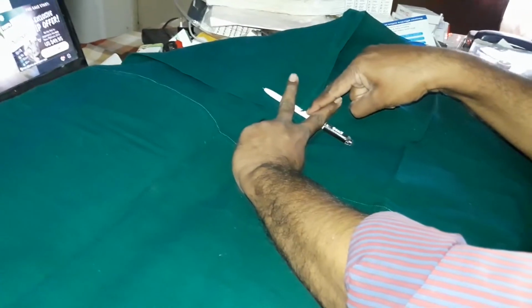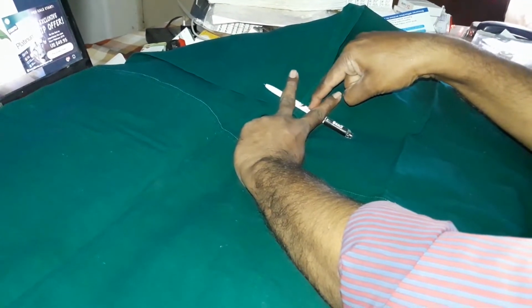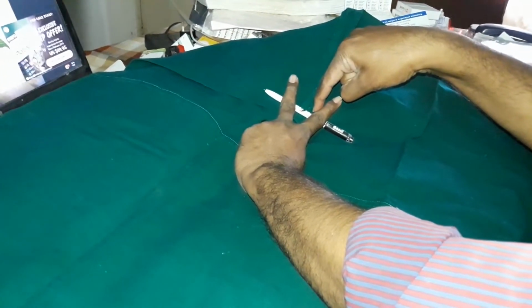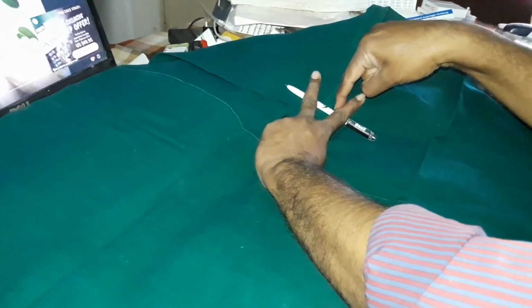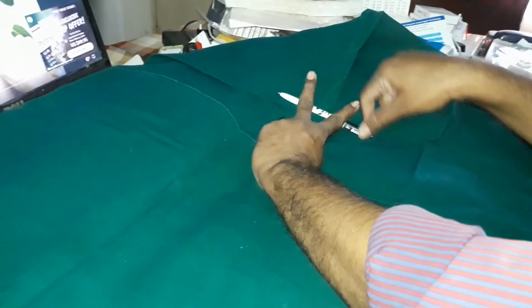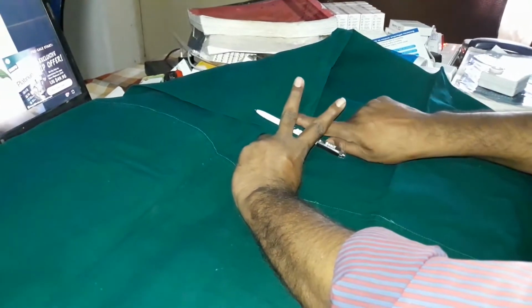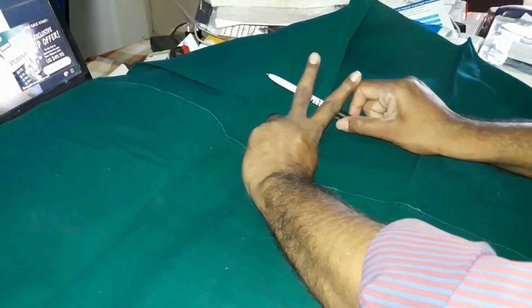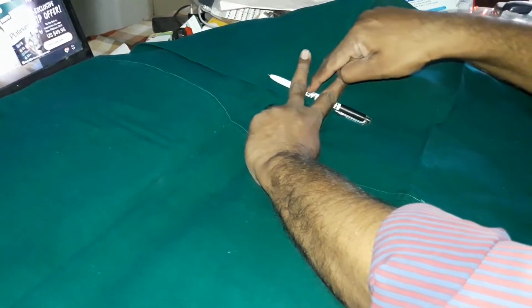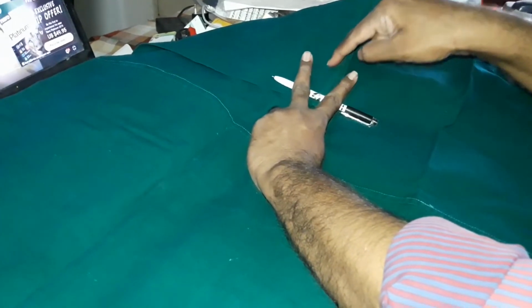This chordal crest attaches to the chorda and the pyramid behind. This small ridge of bone, the pen is on the chordal crest, divides the facial recess into upper space and lower space.